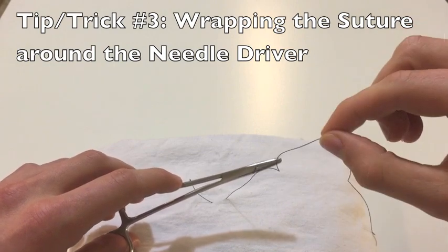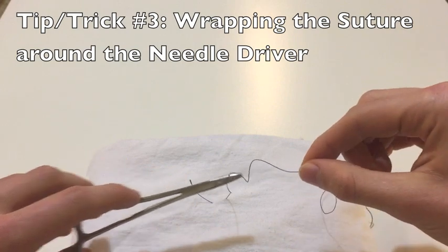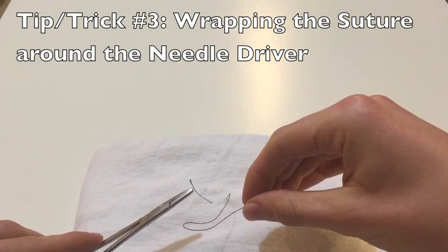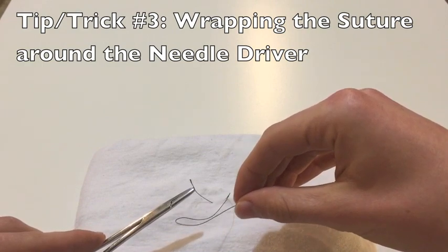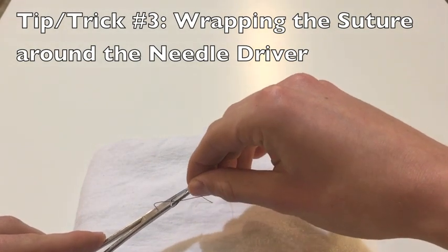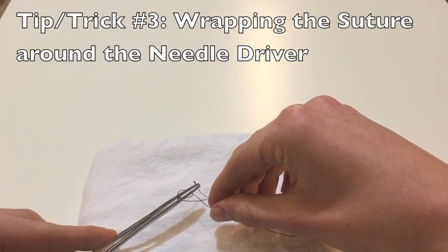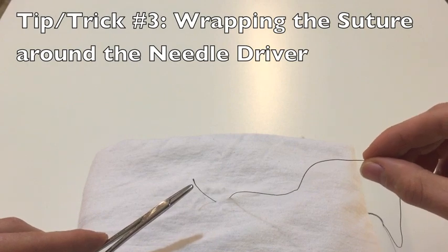In addition to spinning the suture around the instrument rather than the instrument around the suture, positioning is key. I want my instrument tip to be very close to the free end, so that as soon as I wrap my suture around my instrument tip, I'm ready to grab the free end. So I hold it very close to the free end, wrap my suture around the instrument, and then it's a very small distance to grab that free end. That is my third tip: how to wrap the suture around the needle driver.